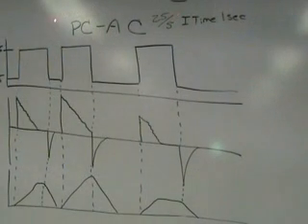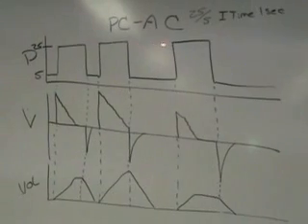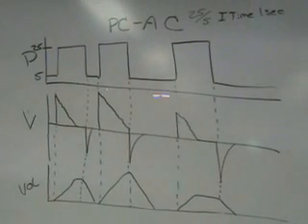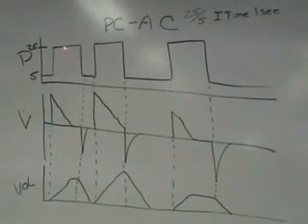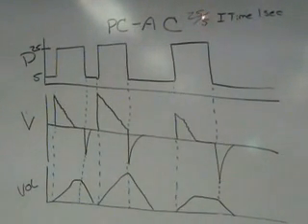Okay, here we're talking about pressure control, assist control. I tried to make my pressure scalars all the same, but I'm sloping away a little bit here, so I apologize about that. But my settings for this mode of ventilation are 25/5.